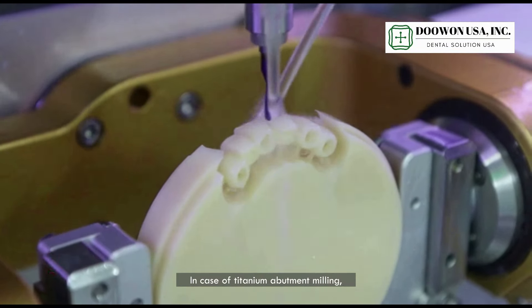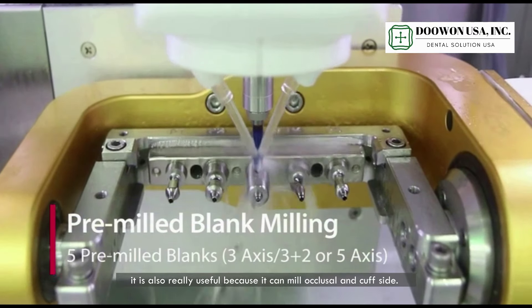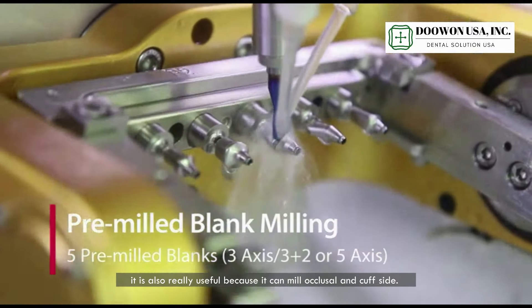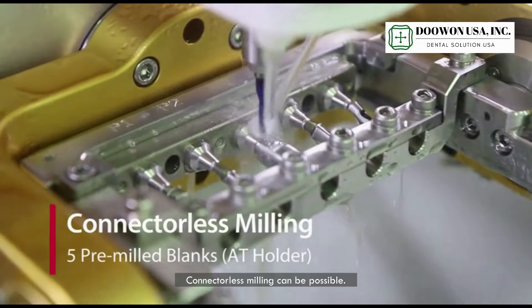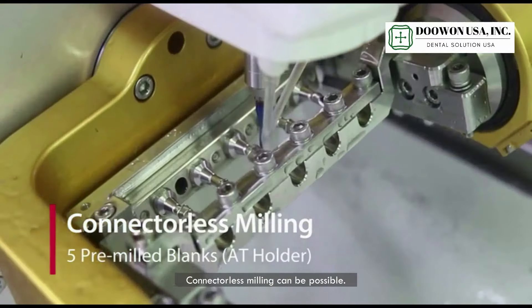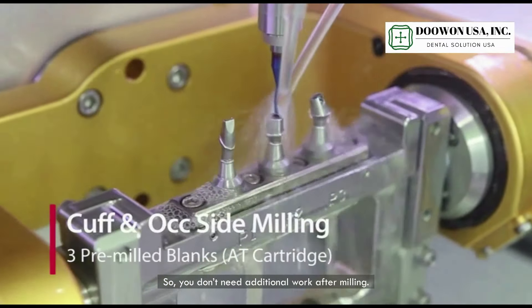In case of titanium abutment milling, it is also really useful because it can mill occlusal and cuff side. Connectorless milling is possible, so you don't need additional work after milling.